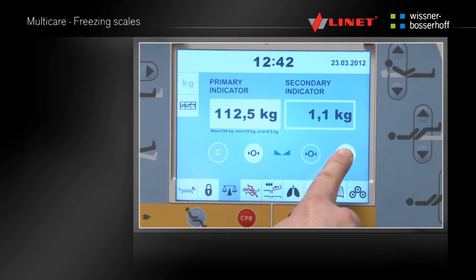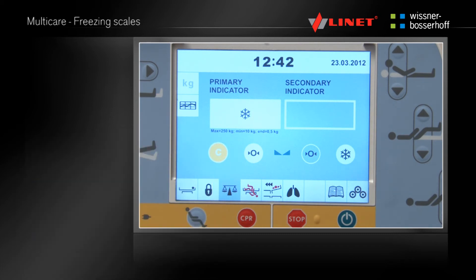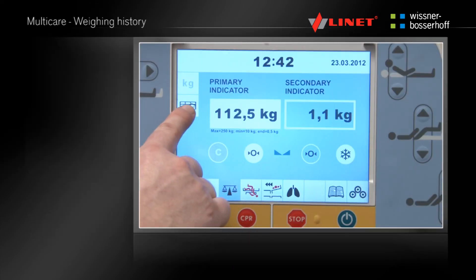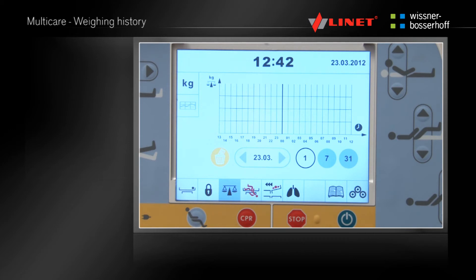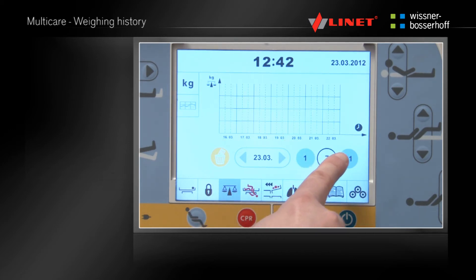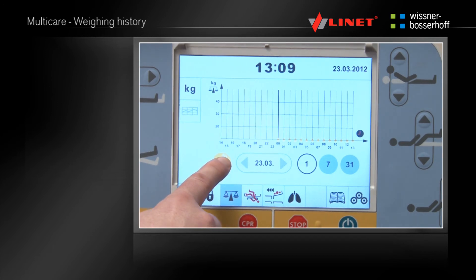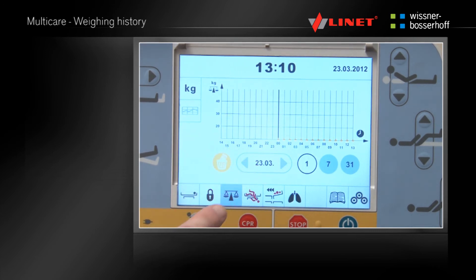Press the snowflake button to freeze the scale. Freezing is used for adding or removing accessories without having any effect on the patient weight. Press the graph button to access the weighing history — daily, weekly or monthly values can be checked. Zero the history by pressing the bin icon button and confirming. To return to the scales menu press the kilogram pound button.